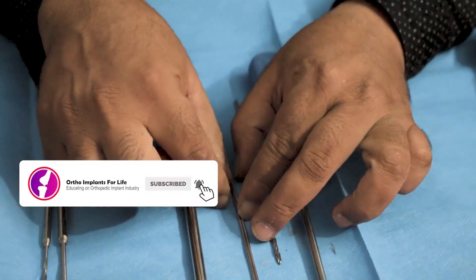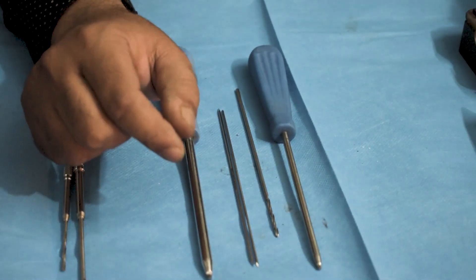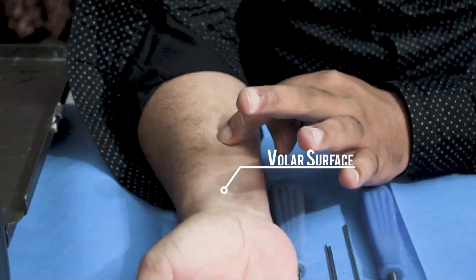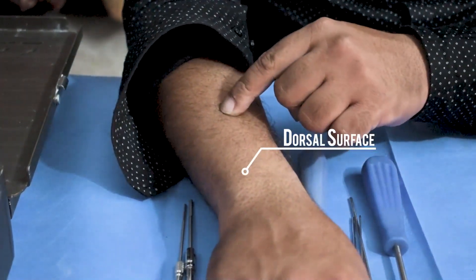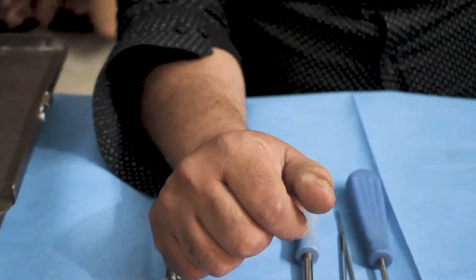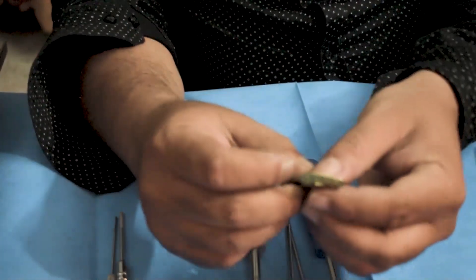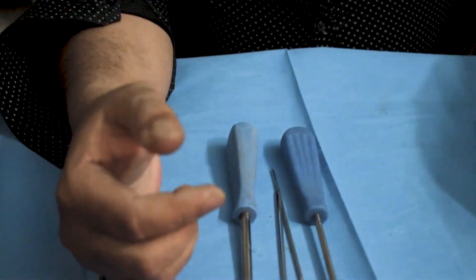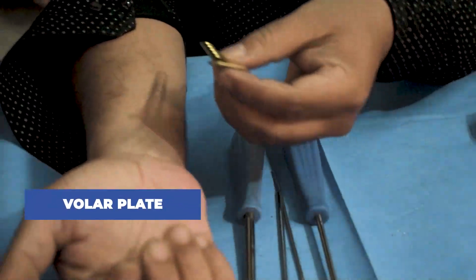Apart from that, distal radius fracture can also be fixed using plates. This surface is called the volar surface and this side is known as the dorsal surface. Here we are going to discuss the plate which is to be used for the volar surface. This is a volar plate.